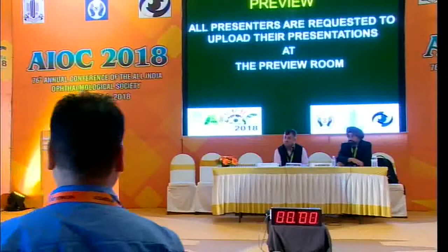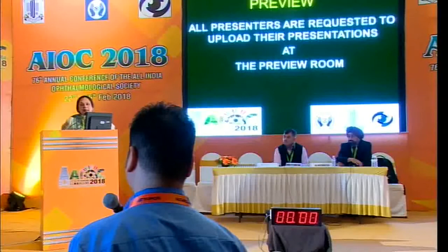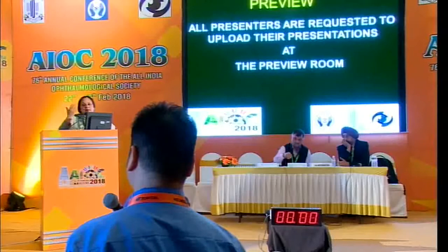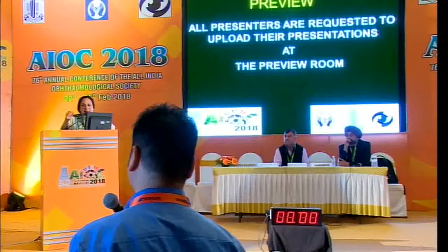Sometimes when you have a break in the tractional retina, the retina becomes mobile and it becomes very difficult to separate the membrane from the retina. It's a good idea to start at a place where the retina is still attached and gradually work your way towards the area where the retina has become mobile. Because if you go from the mobile to the less mobile retina, you will have the retina jumping into your cutter. Go on a shave mode with very high cut rate, very low suction, so that your cutter is actually like a razor, just cutting very close.